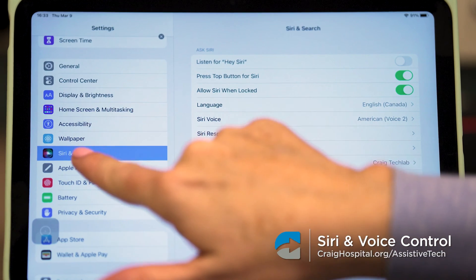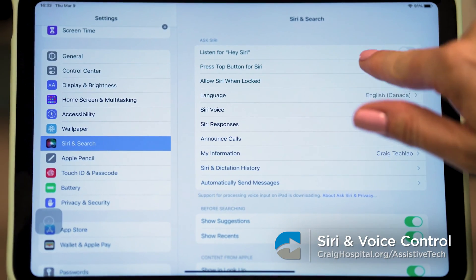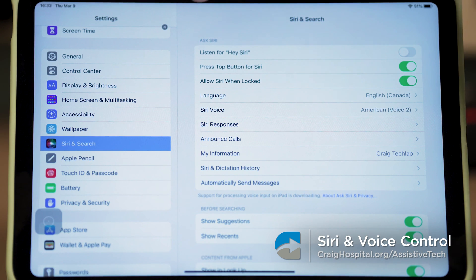I'm Sarah from the Assistive Technology Lab at Craig Hospital. Today I'm going to show you the sequence for how to use Hey Siri and Voice Control on an iPhone or an iPad. The first thing to do is go to your Settings and find the tab that says Siri and Search.